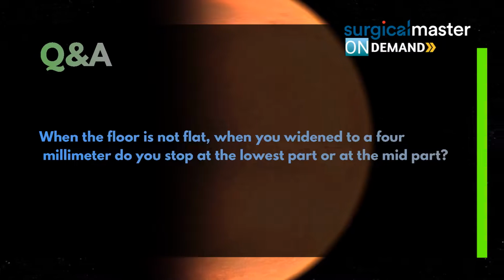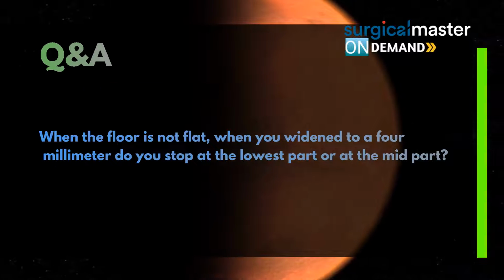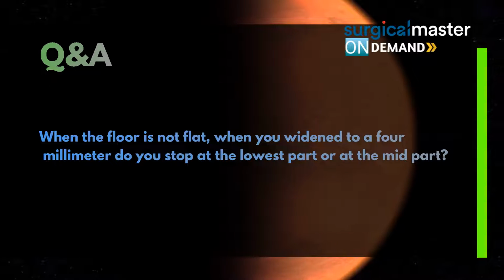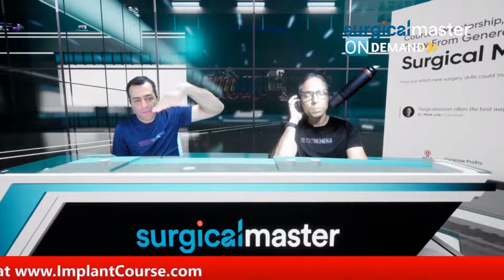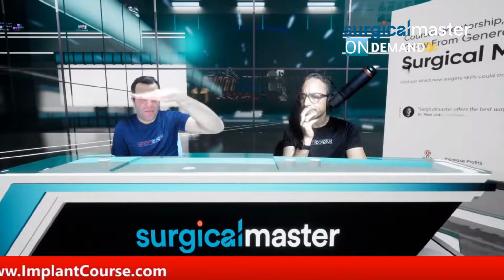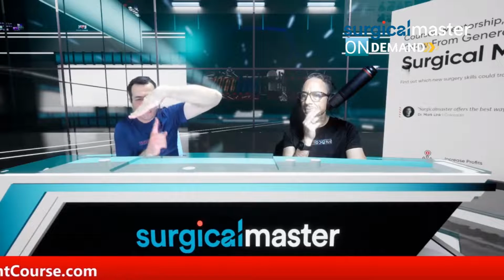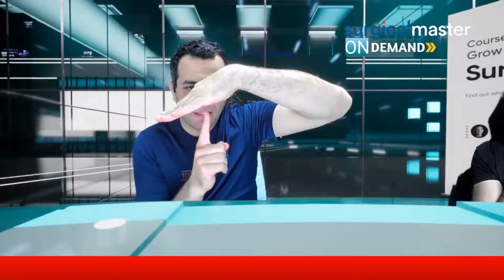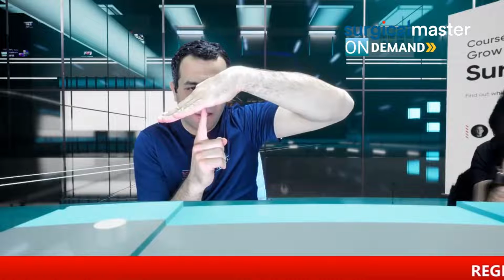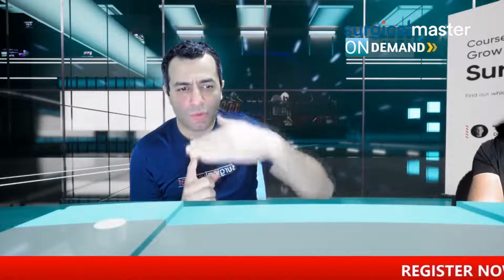When the floor is not flat, when you widen to 4 millimeters, do you stop at the lowest part or at the mid part? I didn't understand the question. If the floor of the sinus, Ziv, is slanted, and when you drill, do you stop at the lowest part or at the mid part? The lowest meaning the most coronal. The most coronal.